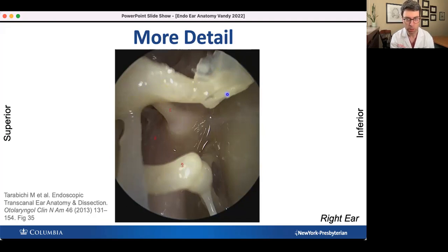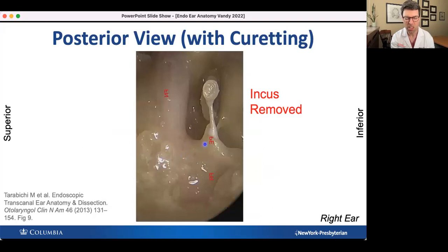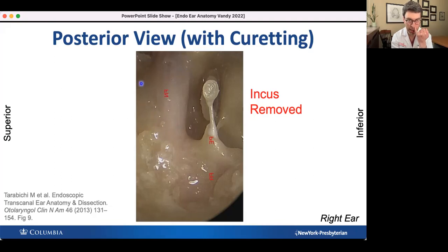In this dissection specimen, the tympanic membrane has been removed from the malleus. Here's the facial nerve — this thick, pink structure. Now let's remove the incus and curette a little. With the incus removed, we can see the stapes in more detail: here's the head, the anterior crus, the posterior crus. The stapedius tendon attaches to the neck of the stapes and inserts into the pyramidal eminence. Directly superior to the stapes is the facial nerve, and even superior to that is the horizontal semicircular canal. The horizontal canal, facial nerve, and stapes form three parallel lines.